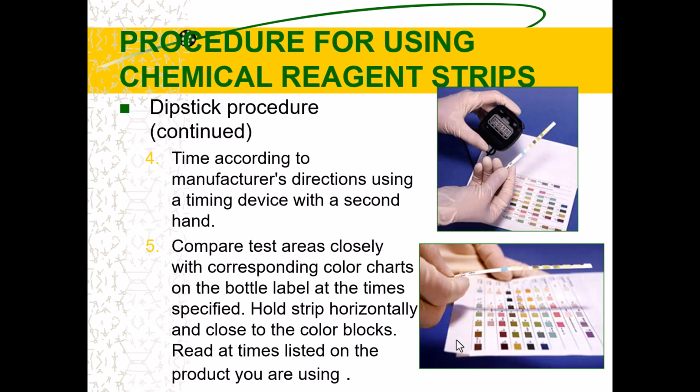So then we're going to time it. Like I said, each of these has a different amount of time. Like this is a piece of paper, they're boards. We actually use the sides of the bottles. When we have people that don't do this as often, or we have like high school kids in, we give them the boards because it's easier, but you guys need to learn to navigate the bottles, so we use the bottles. You use the seconds, all of our clocks have second hands. That's plenty fine. It doesn't have to be, oh, I went 21 seconds. That's okay. 20 seconds is what we're looking at though.